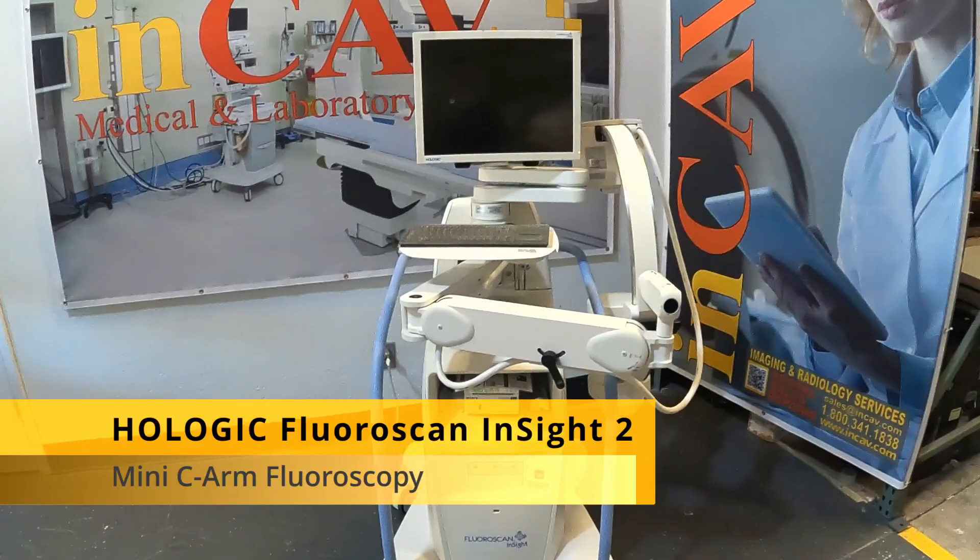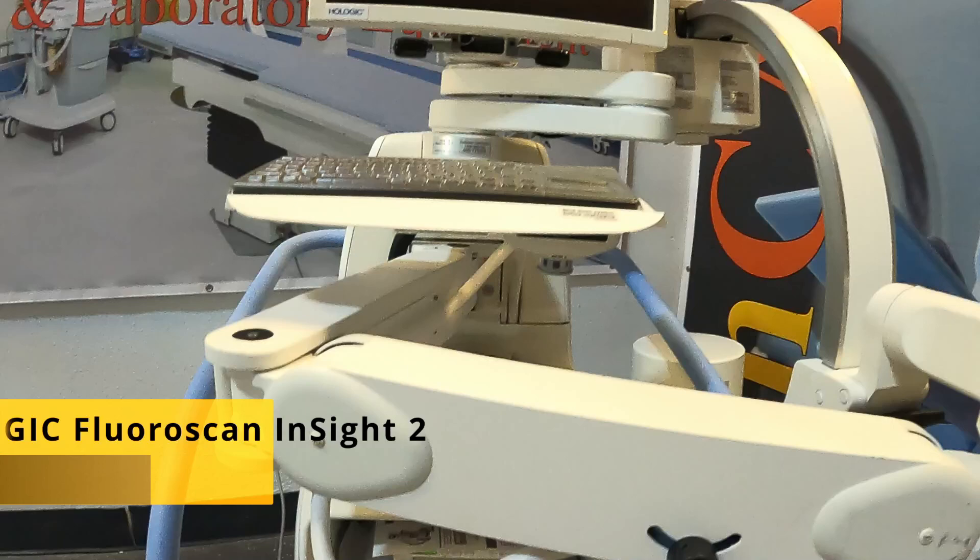Welcome to NCAB Medical. Today we are going to see the Mini-C Fluoroscopy Machine, Fluoroscan Insight 2.